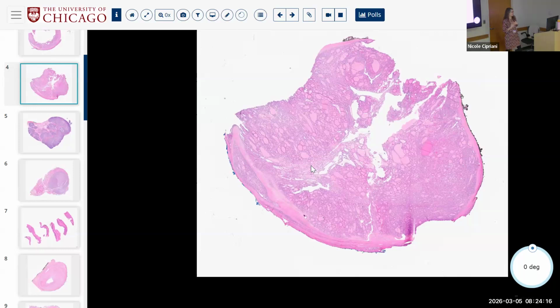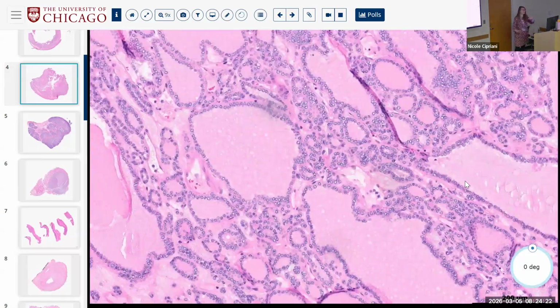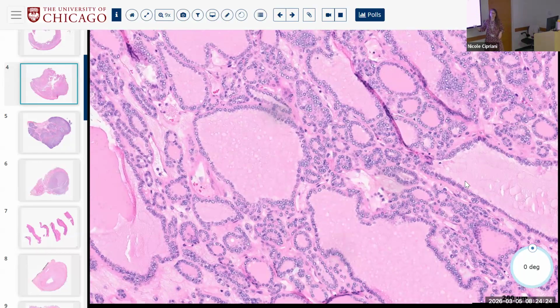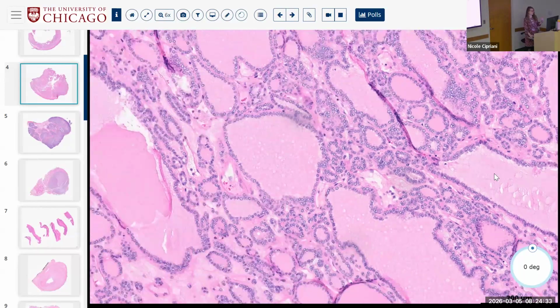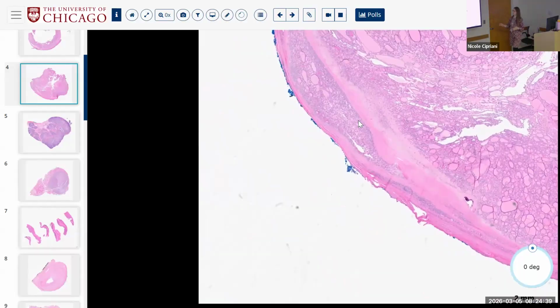As you know who signed out with me, I don't use UMP, but it's out there. I will say thyroid neoplasm with nuclear irregularity, architectural irregularity, nuclear and architectural irregularity, and say these are the diagnostic options, right? But if it's a follicular pattern or a RAS-like neoplasm, mostly your important features are, is there capsular or vascular or extensive invasion? Yeah? Does that all make sense? So in this case, you could UMP it, or you could say follicular neoplasm with peripheral irregularity. I don't think this is true capsular invasion, just observe the patient, right?